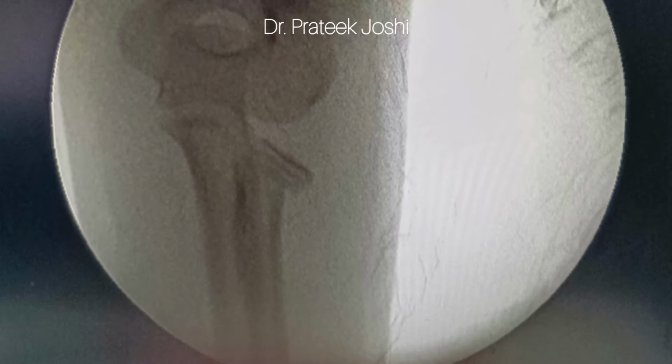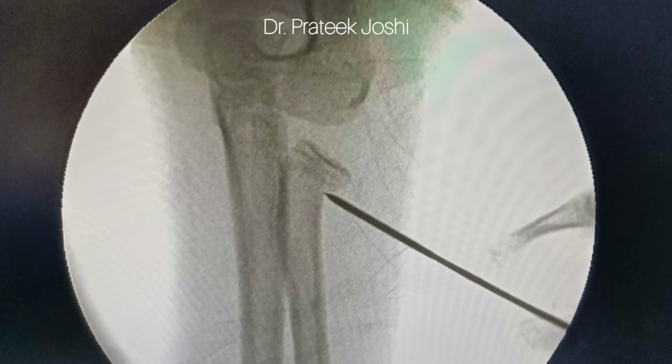This patient had a Judet type 3 radial head displaced fracture, for which we had to do a closed reduction and K-wire procedure. Initially we tried to do a closed reduction, but it was unstable, hence we are going to use a K-wire to stabilize the reduction.